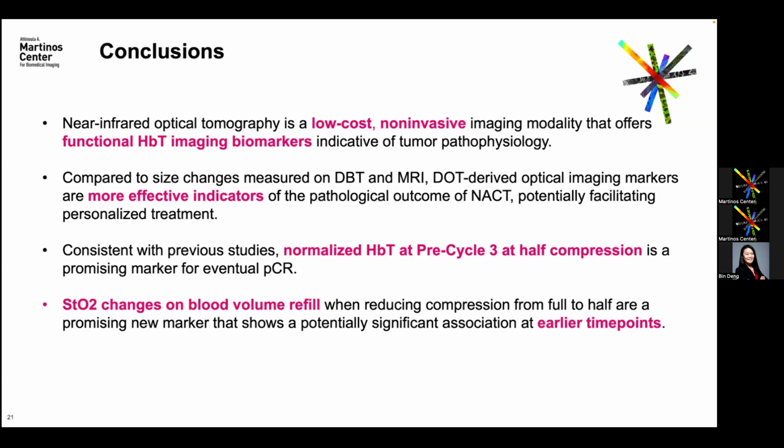Clinical can be done in a few seconds, ours like 60 seconds. But I don't think there's research to show prolonged compression can cause increased metastatic risk, so we didn't investigate that. Thank you for the question.